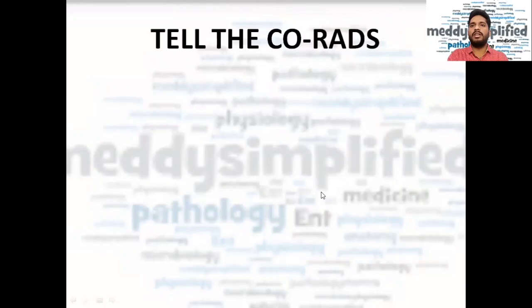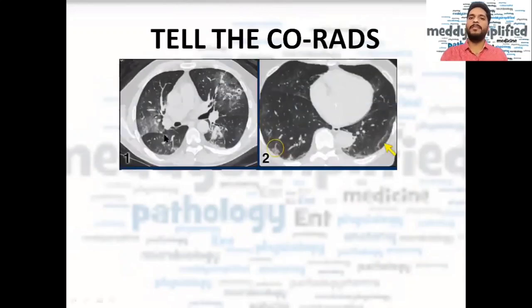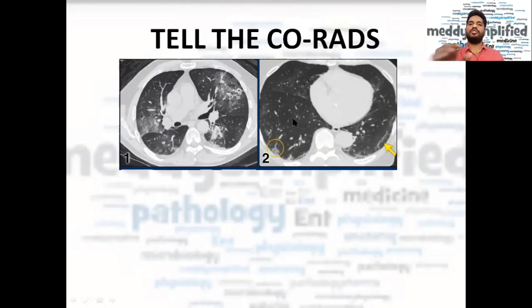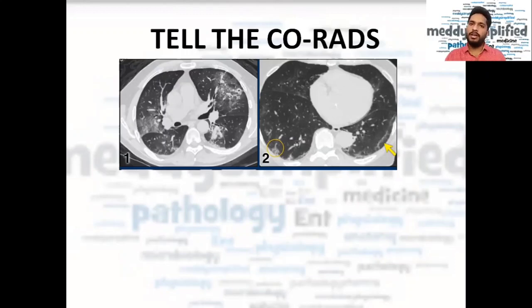Now let's look at two CT cases and try to determine their CORADS rating. Make sure to find the circle and arrow also indicated on the images. Pause the video, observe both CT scans, try to find any abnormalities, note them down, and then play the video again so we can find the answers together.